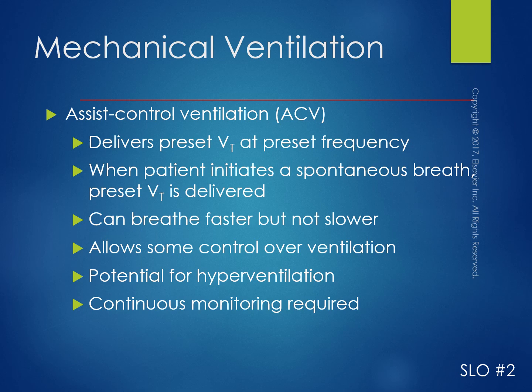Okay, so the risk for this is hyperventilation, because if your patient is starting to get better and taking their own breaths, each breath is going to deliver that full tidal volume. So think about you taking 15 deep, long breaths per minute. For some patients, this is needed. And for other patients, they can potentially become hyperventilated with this.